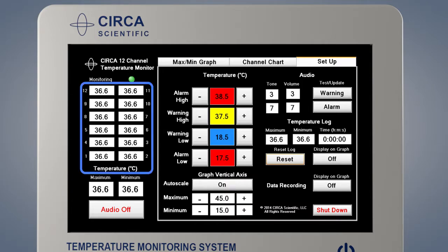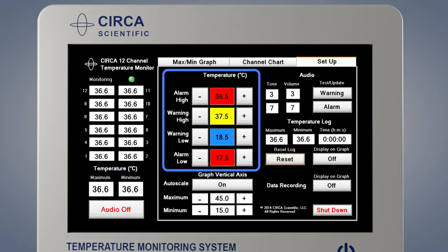Assure that appropriate temperatures are shown on all 12 sensors. From this screen, you may also set warning and alarm limits and adjust the volume, among other functions. The monitor is also shut down from this screen. To adjust the warning and alarm limits, use the plus and minus buttons to change the values. The high warning limit must always be lower than the high alarm limit. The low warning limit must always be higher than the low alarm limit.